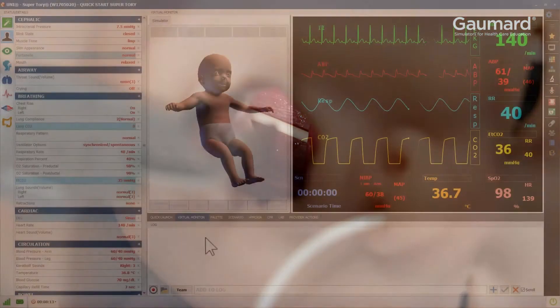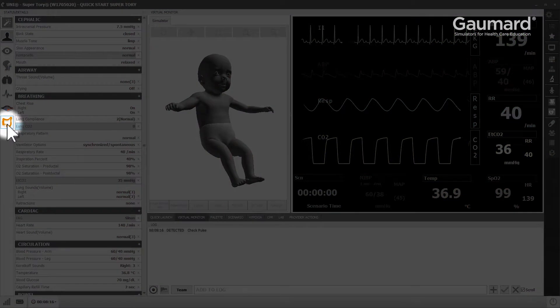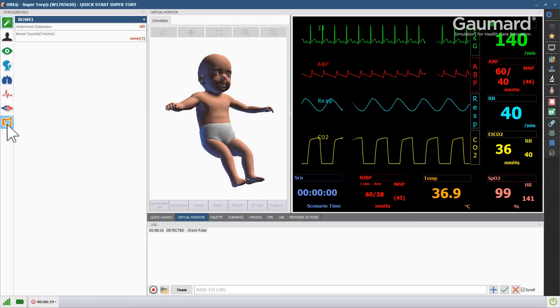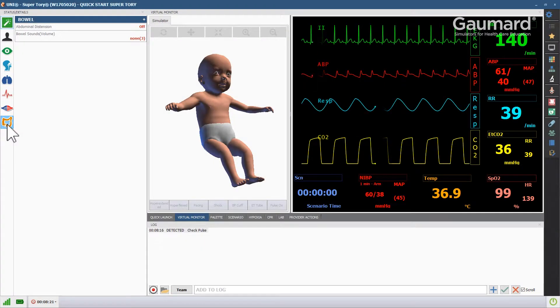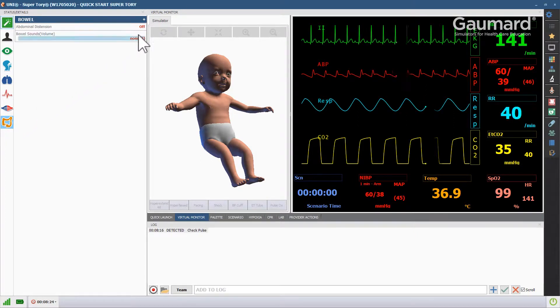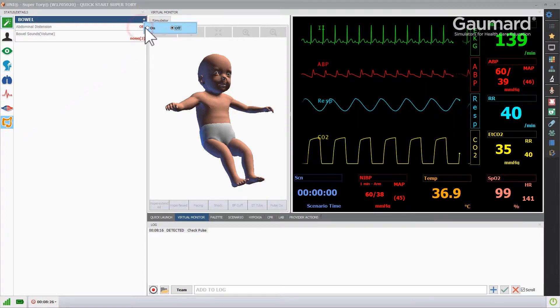In the event of excessive bag valve mask ventilation, Supertory will display gastric distension. You can also program distension in the gastrointestinal submenu — click the gastric distension vital and click on.